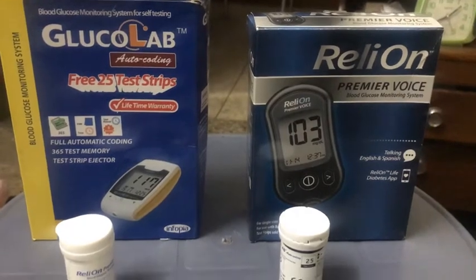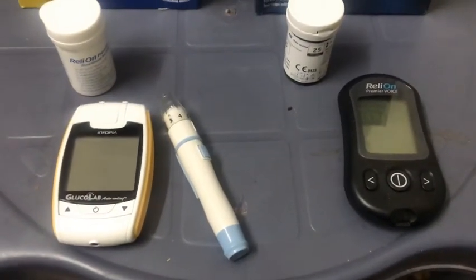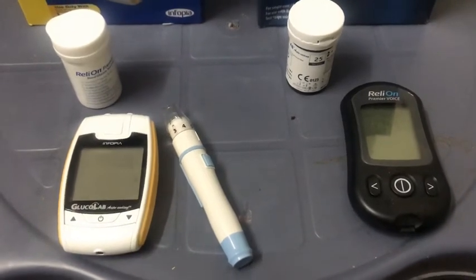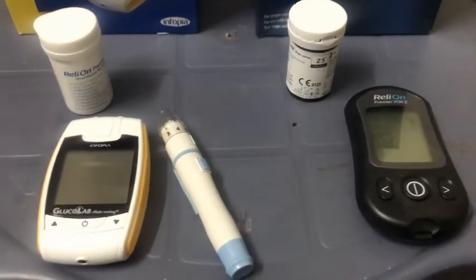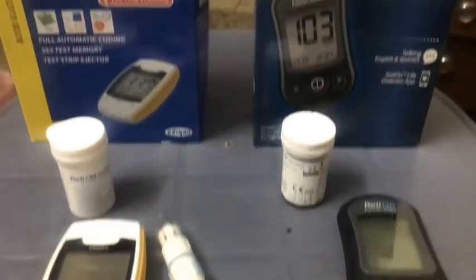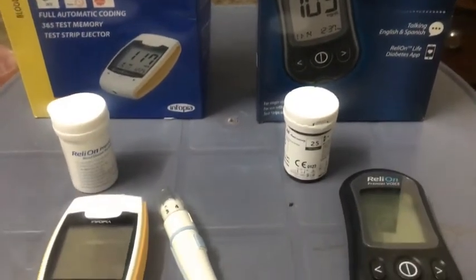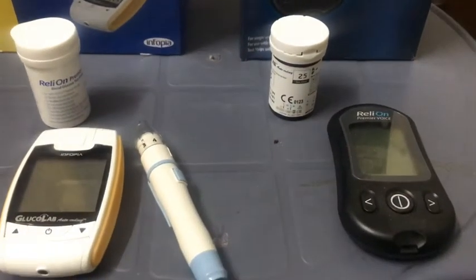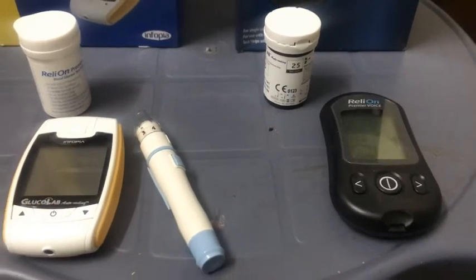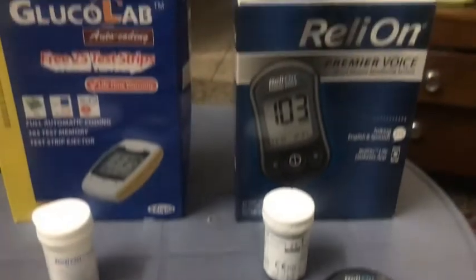My target is that if they differ by 20 points or so, that means both are very close to accurate. But if the difference is more than 20 points — maybe 50 or 60 points — then there's some dubiousness in the reading. So let's go ahead and do the testing. I'm going to test on the same blood on both meters.